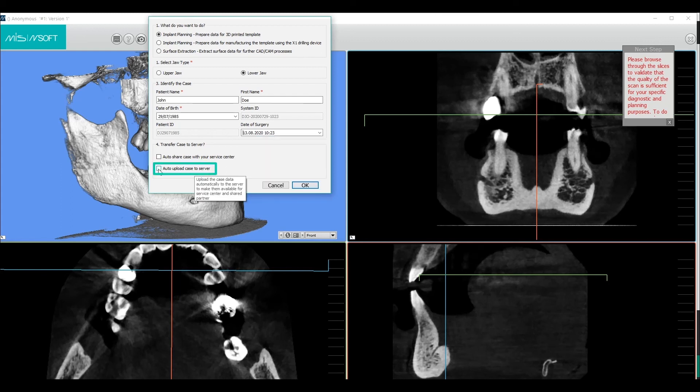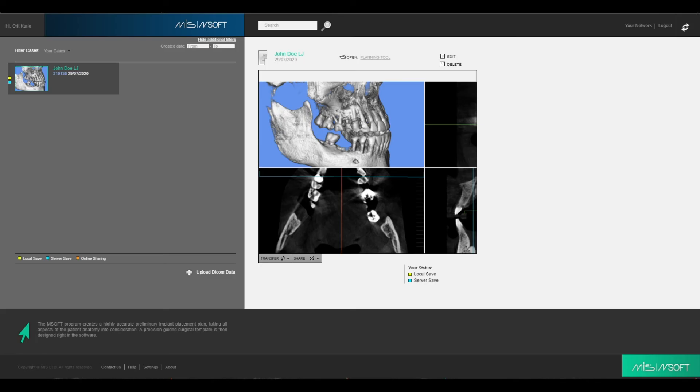Auto upload to server: this will ensure that the case data will be saved on your server for up to seven years, and you can find it at any time in case of a technical problem.